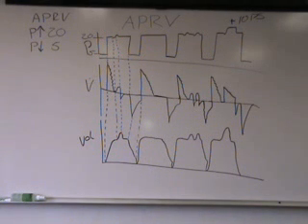And then that volume comes back out because the person actually exhales, shown here in the pressure scalar and here in the flow scalar. So that little bit of volume that they breathed on top of the volume that was previously delivered comes back out. At the end of the P high time, that pressure gradient goes from P high to P low, so I see expiratory flow, and I see the volume coming back out.